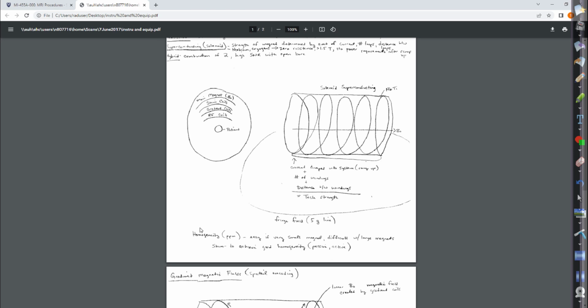Our shim coil is designed to make the magnet as homogeneous as possible, and its unit is usually in parts per million. So remember, the engineers, that's their responsibility. The moment that magnet's dropped off into the department or craned in or however they get that magnet into the department, one of their main purposes is getting that into a very uniform magnetic field strength. And it could be in the range of over 30,000 parts per million when it's dropped off, and they have to use active and passive shimming to get it down to less than 4 parts per million before you can start scanning a patient.